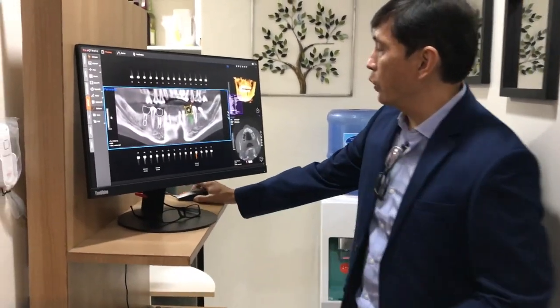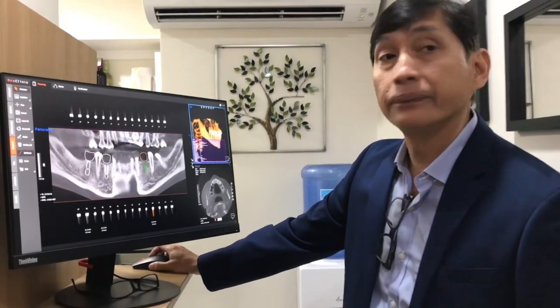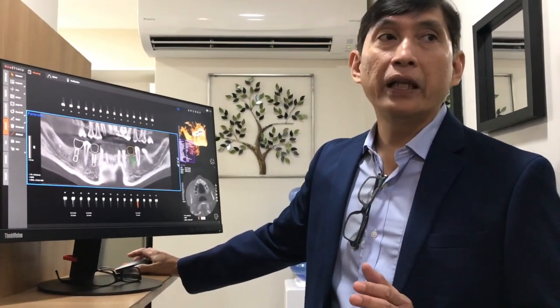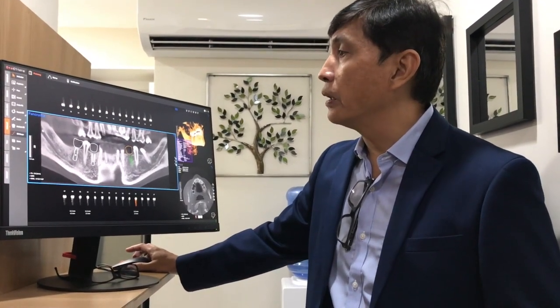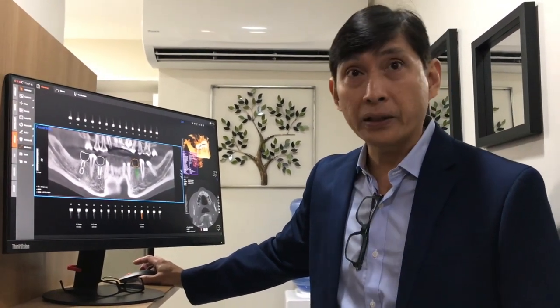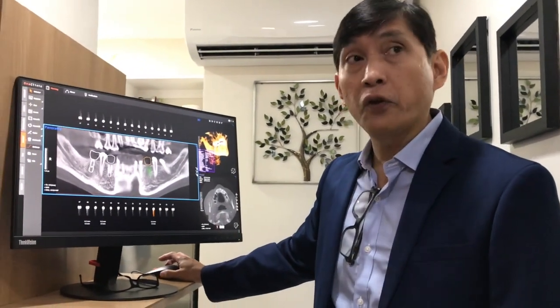So you can see we can manipulate it. And here, right then and there, we can know if the patient is a candidate for an implant or not, because we know where the vital structures are. This is the nerve. This is one thing that we avoid when we do implants. So this makes it much safer for the patients.